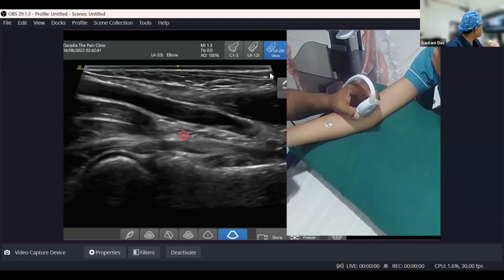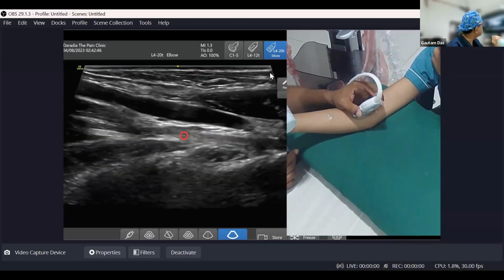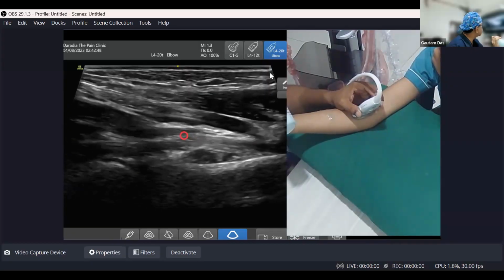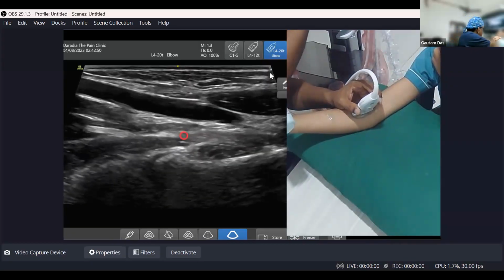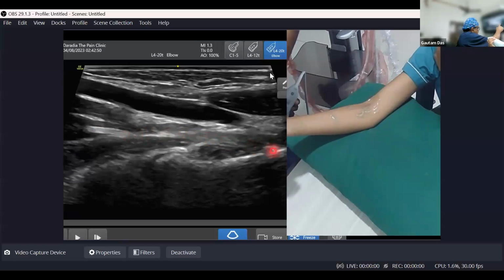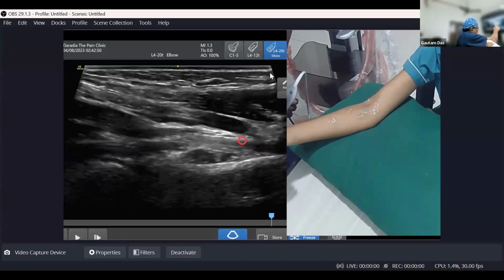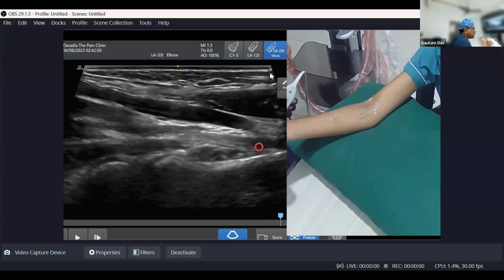And now at this point, you can see this is your distal biceps tendon getting attached. So this is another way to see. So this was your tendon getting attached. Here I am able to see it better. Why? Because I was seeing through the brachial artery. So anything you see through the brachial artery or through other vessels.